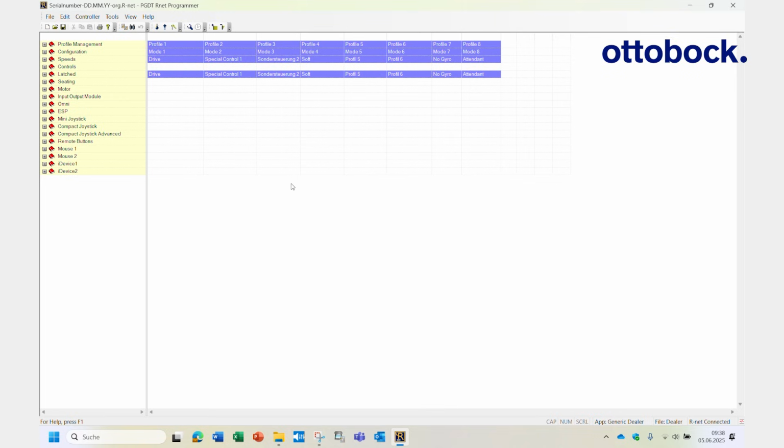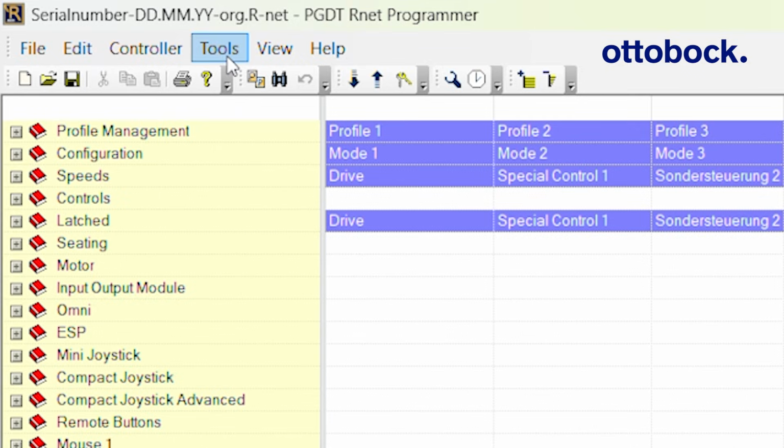In this video, you'll learn how to use the PC programming station for the Penny & Giles RNet control system to diagnose and monitor system functions. These functions make it possible to view system errors and observe operating values in real time.